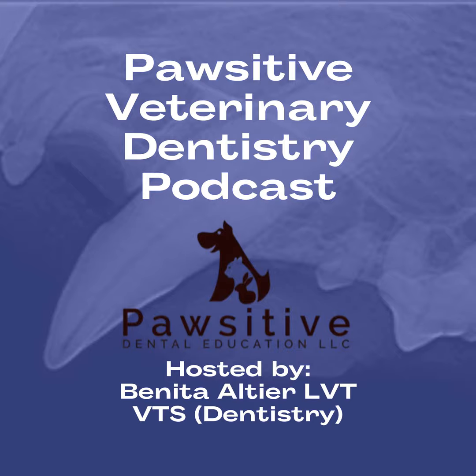It's a really, really great, well done study by that group that is the basis of what I always recommend to owners and to students and to general practitioners. It's really imperative to be able to take those radiographic images of the full mouth so that you can provide the care that your pets need, or to give you a heads up if there's a super curly dilacerated root in there. That may not be one that you want to tackle, and it may be one that you want to unfortunately send my way, I guess, to try to tackle.